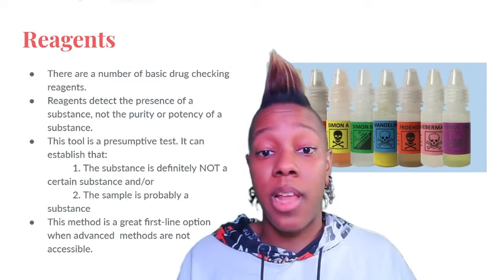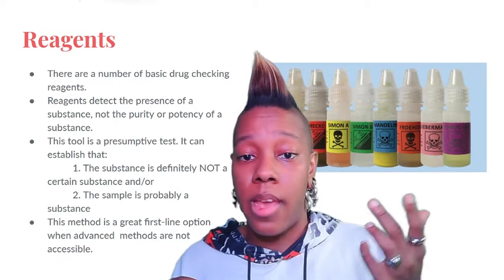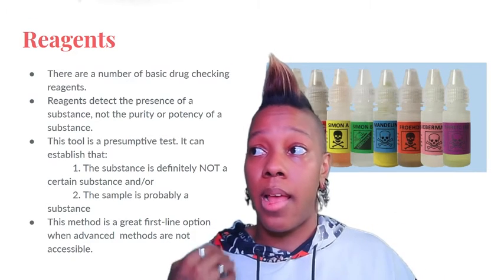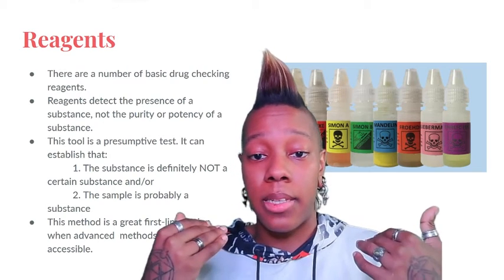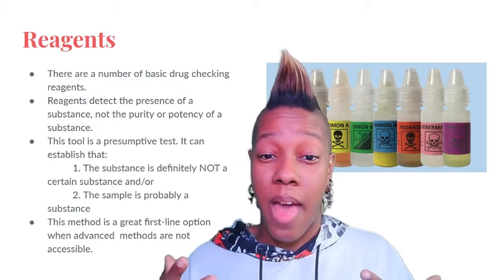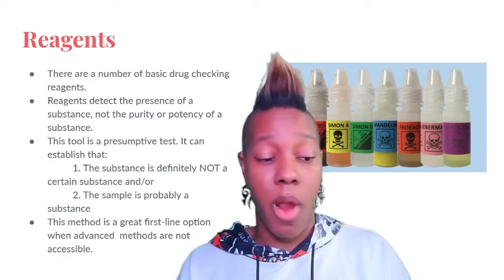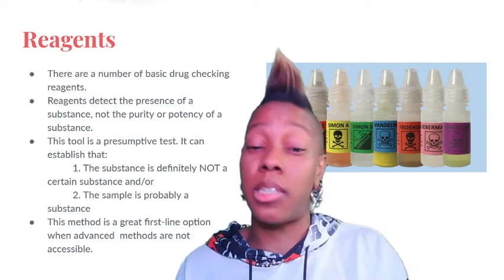So like I kind of mentioned, if I were to drop a reagent on a chemical, it's just a liquid. If I were to put that on a chemical, what it does is give a color reaction. Like I was saying, an example about benzofurans and them being potentially conflated with MDMA. Something like that is very difficult for a lot of reagents to tell the difference between, because MDMA with the Mecke reagent, the Marquis reagent, and the Mandelin reagent all test basically to black.